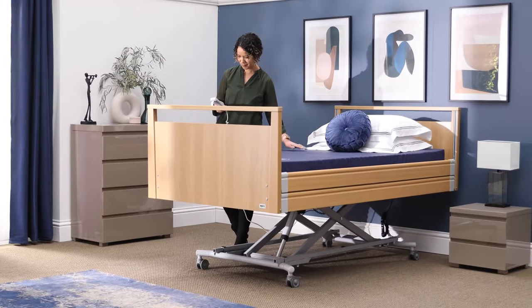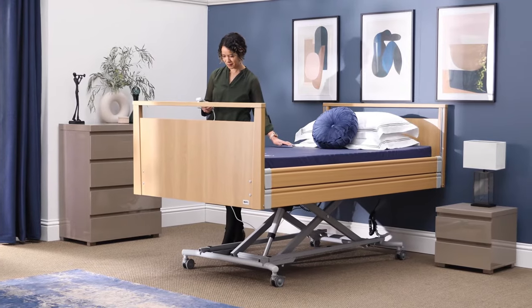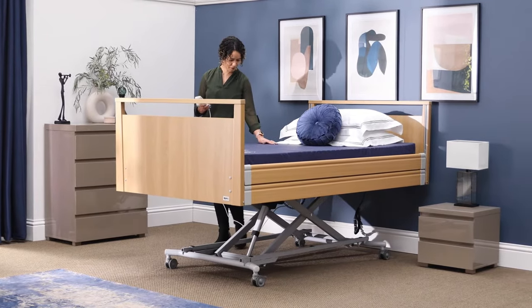Assisting transfers in and out of bed. Most Opera beds can be raised to a carer's waist level for nursing care on the bed. Having an adjustable height bed is so useful for me as a carer, and for anyone else caring for anyone that needs assistance. And it saves your back so much strain.